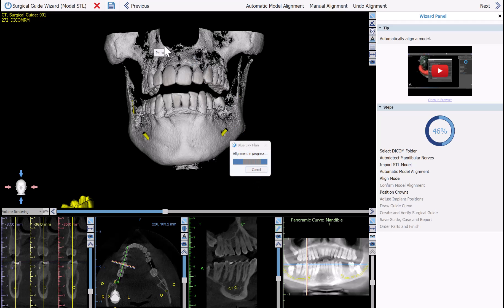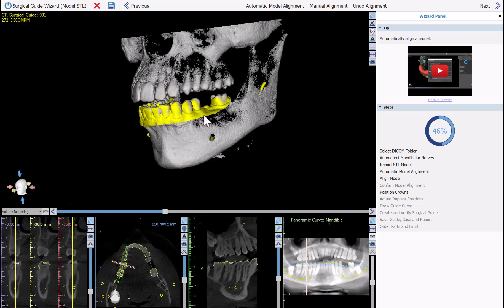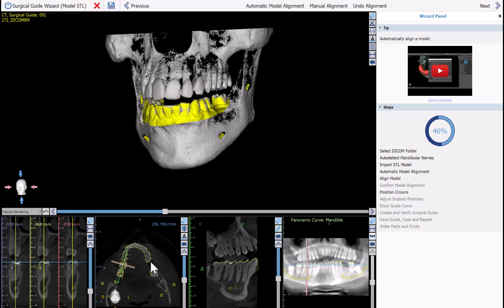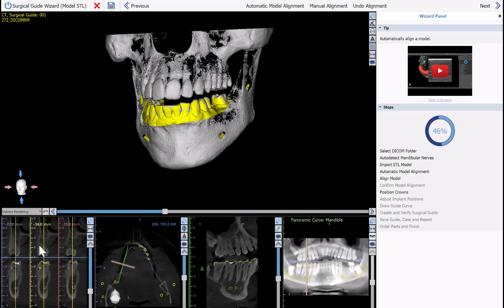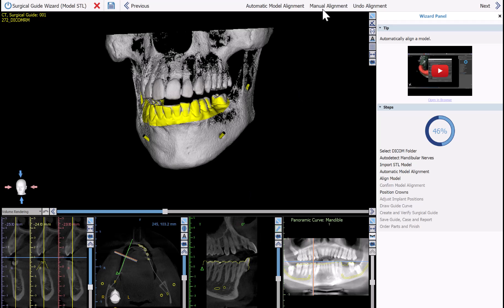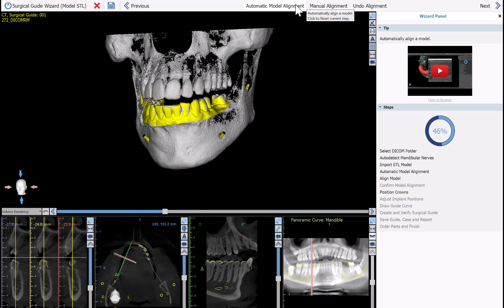The software now performs automatic model alignment, automatically aligning the optical scan to the CT scan. We can now see the automatic model alignment. It's important to confirm the alignment in the 2D view windows — you want to see the outline of the optical scan tightly wrapped around the teeth in the axial view, especially as you get closer to the occlusion, and in the tangential and cross-section views as well. If manual alignment is needed, simply click Manual Alignment. If you'd like to rerun automatic alignment, that option is available at the top of the screen.